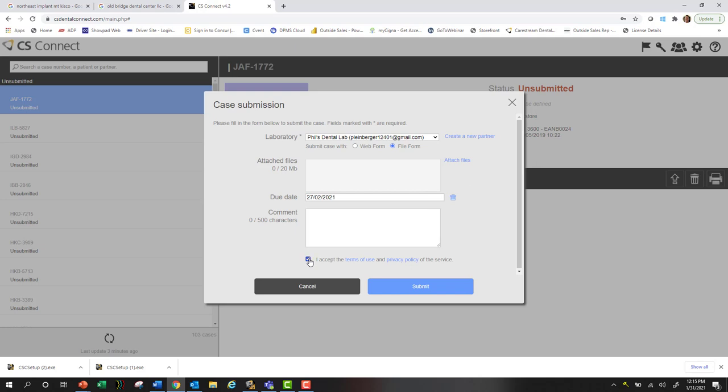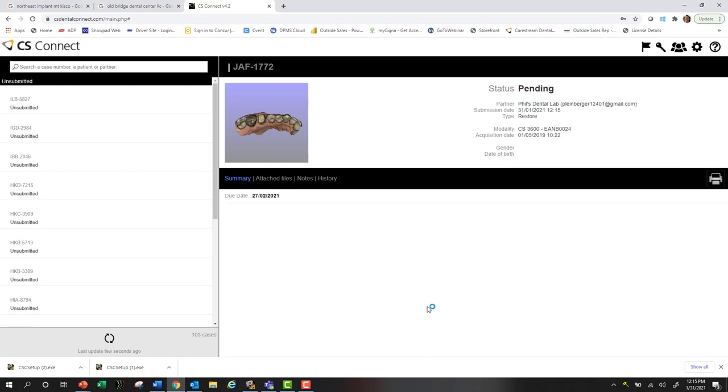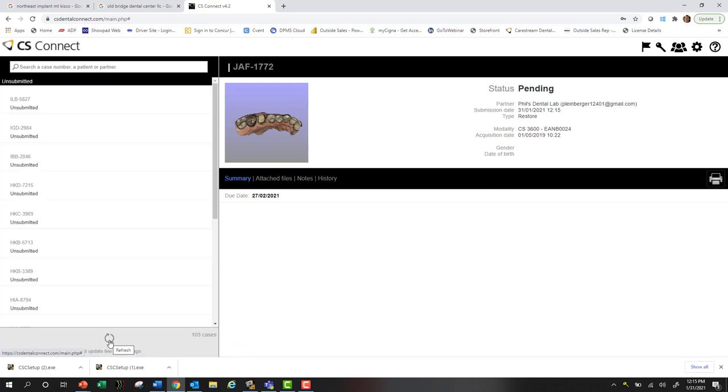You're going to notice it's going to go from unsubmitted to pending. You've got a refresh icon down here, and you'll see it next goes to transferring.